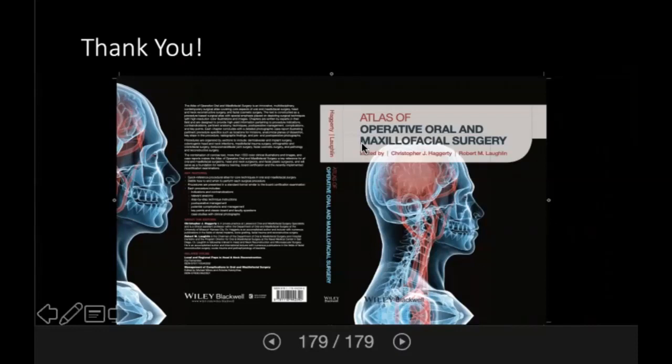That's a very good question, and I want to answer it in two parts. In the ideal world, you would always like to have the implants axially loaded. I think that it gives the implants the best means to distribute the masticatory forces. However, you also want to have the implants emerging through the part of the denture that's going to be the thickest, so that that's where your locator housings can be. So it'll be a compromise between where the locator housings will be and actually distributing the force through the implant.